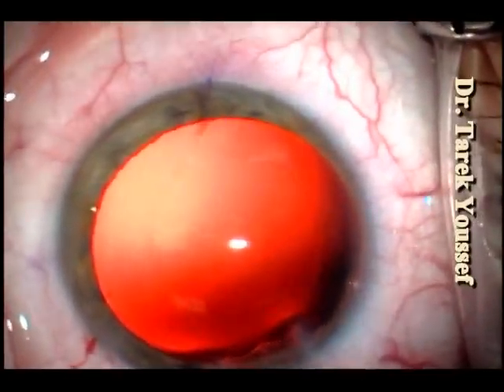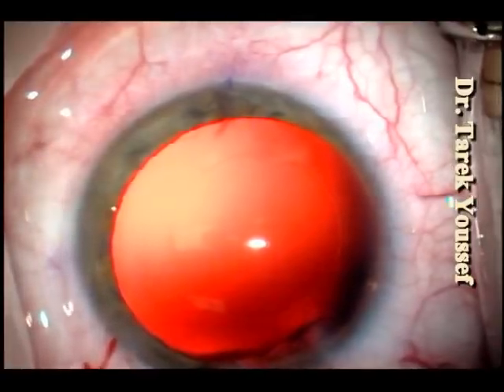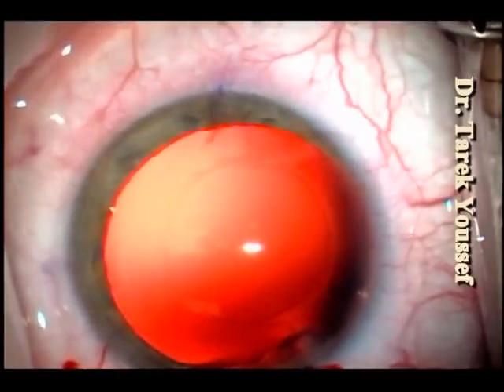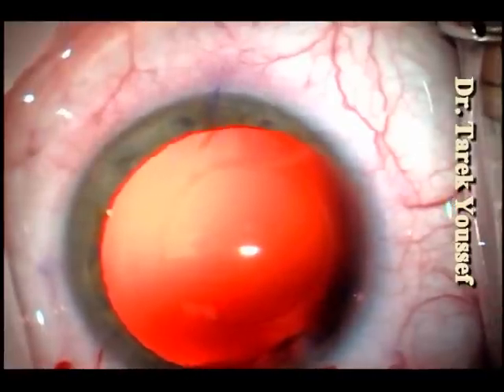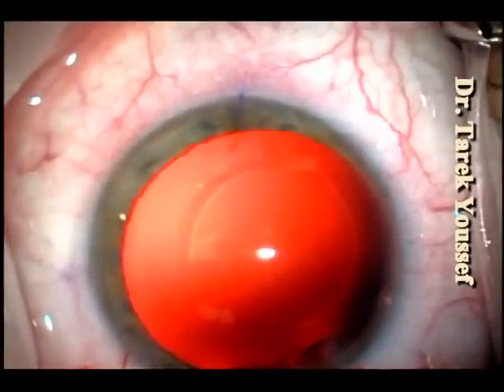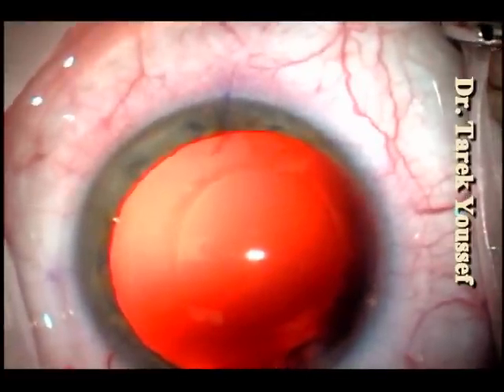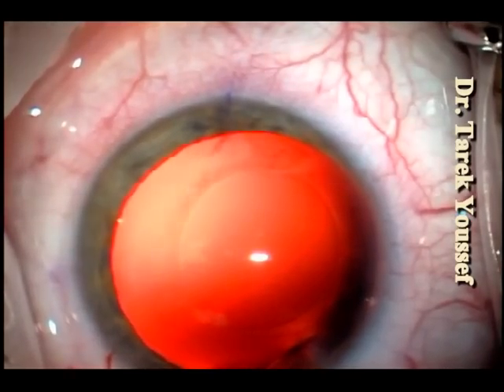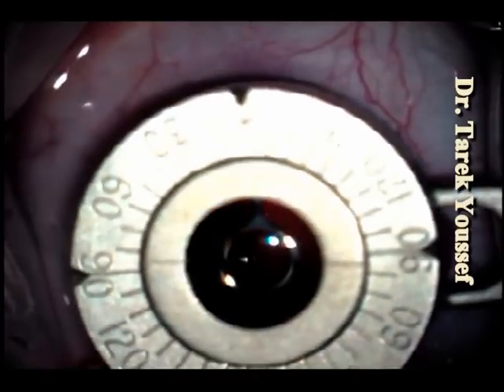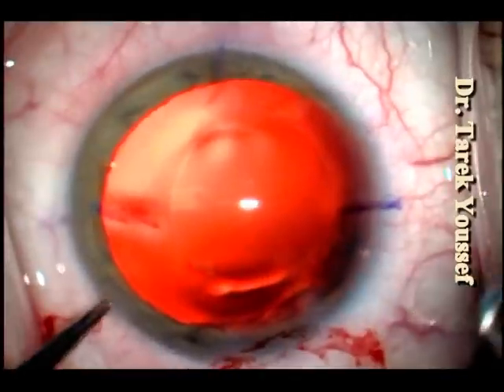Now we're injecting Healon into the anterior chamber. We did a pre-op marking for the 0, 90, and 180 degrees — you can see a faint marking on the top and on the left side of the screen. I usually try to go exactly where I set up the calculator to calculate how much lens we need to implant on the Alcon website. For example, this was the left eye so I go to 20 degrees, and I measure exactly where the incision is so we can accurately align our axis. This is a marker to mark the axis of astigmatism for this patient.